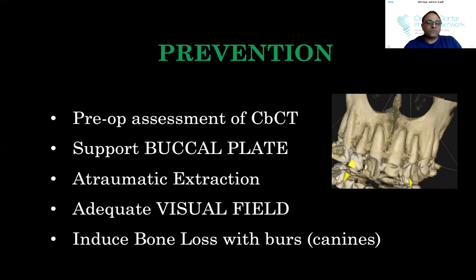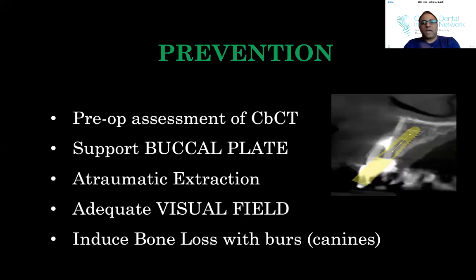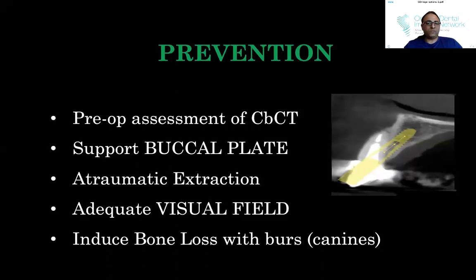Oftentimes for those cases, we have to do that reduction to accommodate the prosthetic and the prosthetic height, okay? So this is a case, again, on the right side, you can see the buccal plate on this tooth. You can actually see the buccal plate. So this tells me, okay, I've got a chance at maintaining the buccal plate. This is on the same patient, by the way. That was the 1-2, this is the 2-2. And again, if you see the immediate anterior presentation, I go through this case in detail on how I managed it. There is no buccal plate. So actually, on the 1-2, I didn't raise a flap. On the 2-2, we did raise a flap, right? And that's what will give you that idea.